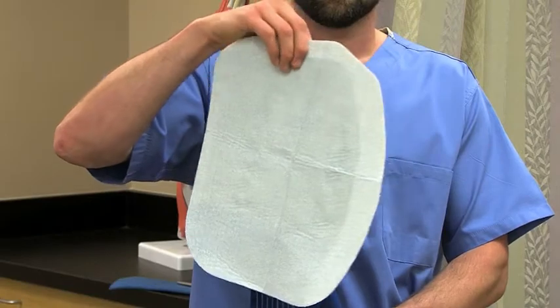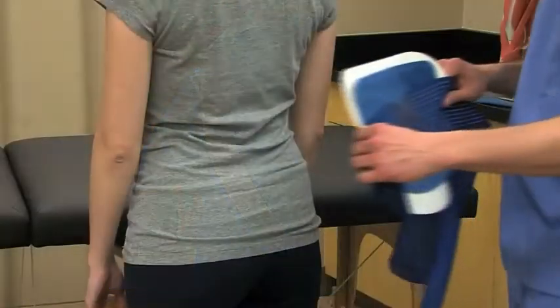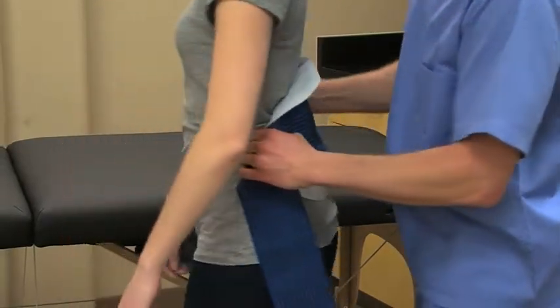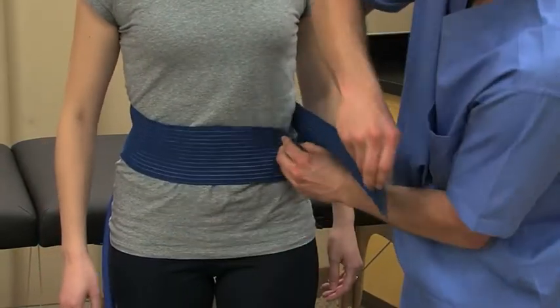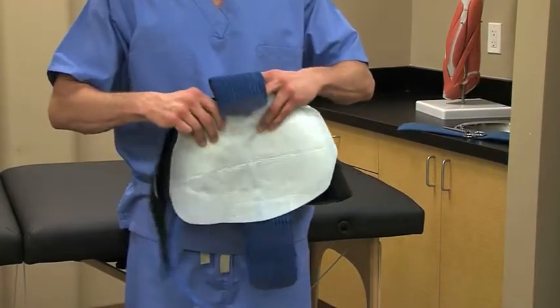With the insulation barrier in place, apply the BackPad with the blue side up. Center the pad on your patient's back and secure the pad by wrapping the elastic straps around the abdomen or torso and fastening them to one another.